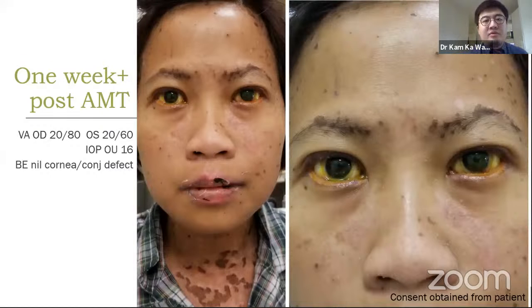At that time, I'm still using the original symblepharon ring that our hospital provides. It cost about $100 US each, and it's single use, so it's quite expensive. But nonetheless, this is what she looked like 1 week after the amniotic membrane. Her corneal defect has healed, her conjunctival defect has healed, and the amniotic membrane looks pretty thin on the ocular surface, and her vision was 20/60 and 20/80.